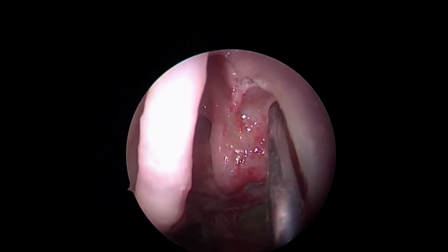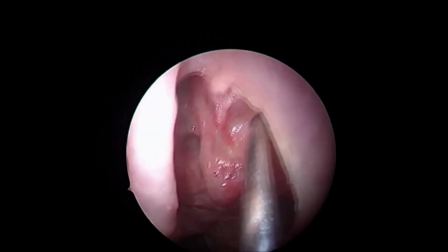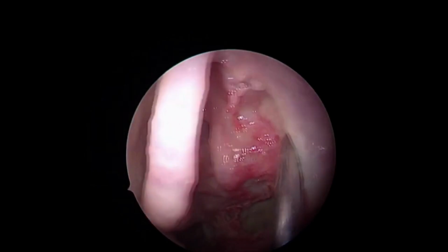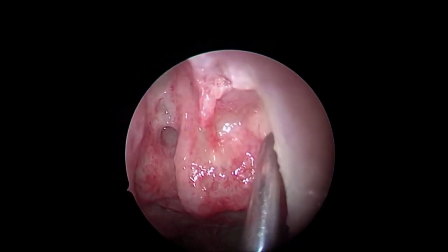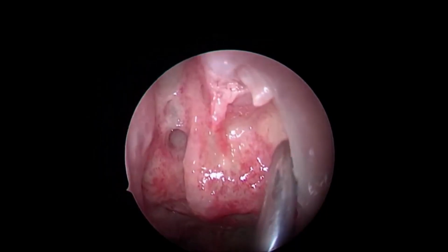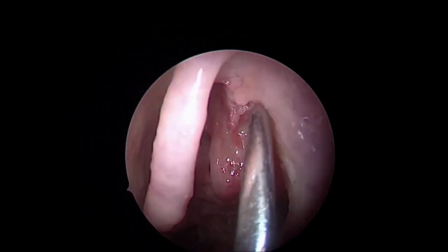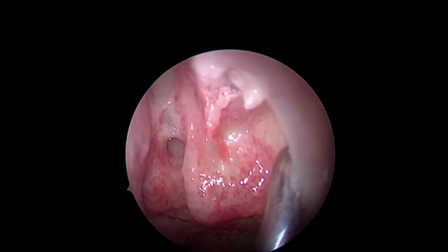And Professor Prepagaran is so experienced, he can blindly do all this. But for the junior colleagues, always go to the radiology, see if it is very close, then you have to be more careful. That is the bottom line. And see, this is the medial wall of the orbit. At the first step of the uncinectomy, we reach the lateral wall, the limit of the entire paranasal sinus dissection. Got my point? So that's the lateral wall of our corridor, that too at the beginning of the surgery, at the first step of uncinectomy when you remove the upper part of the uncinate.